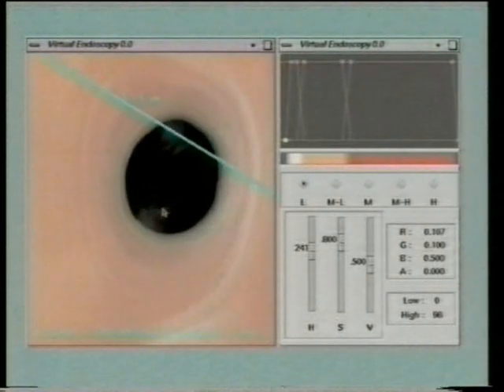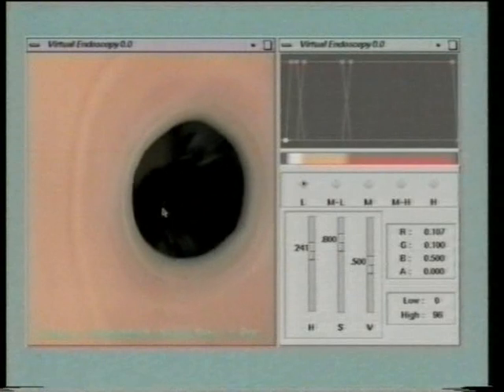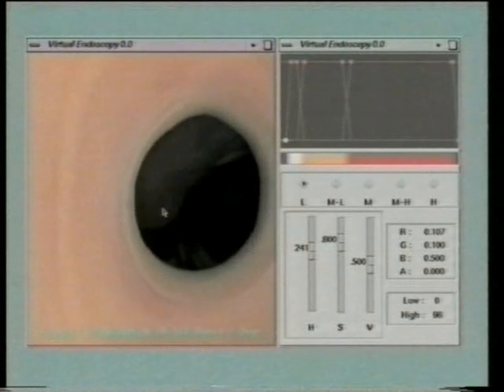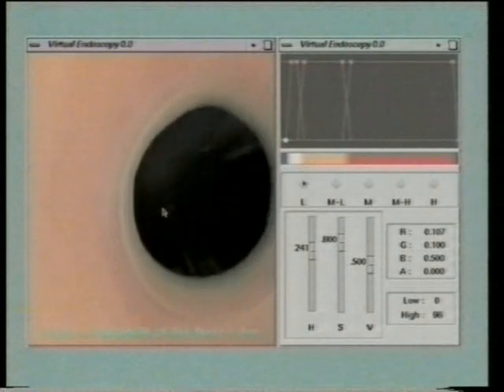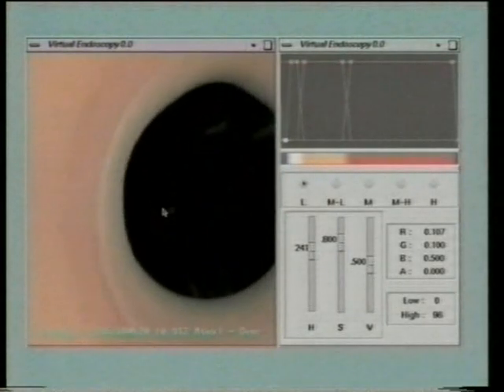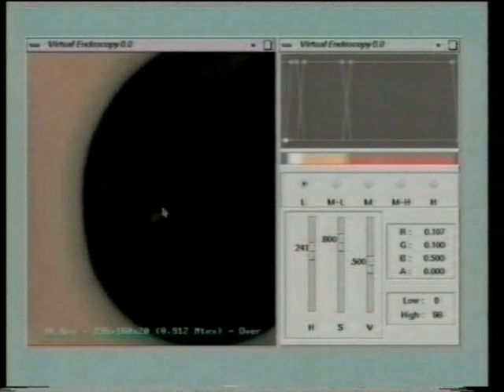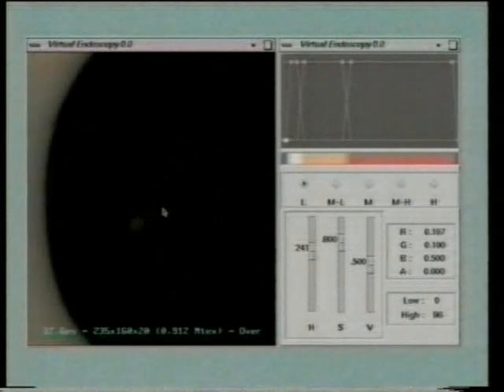we have created a system that aims at supporting physicians in the understanding of the precise spatial location and shape of vessel lesions, which is of primary importance for vascular disease treatment.